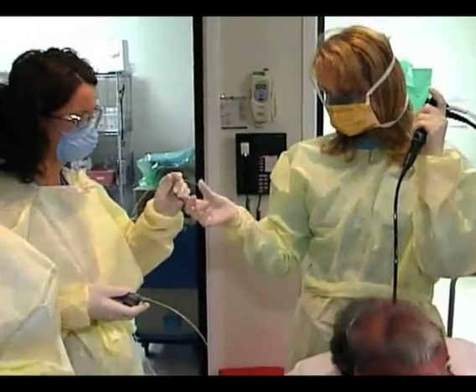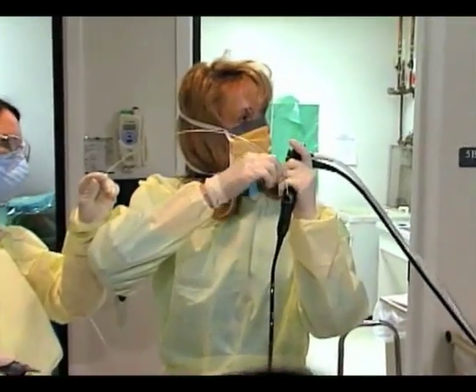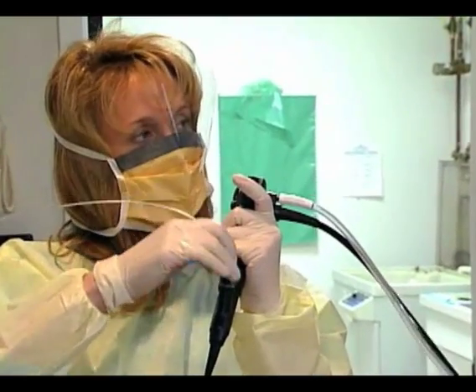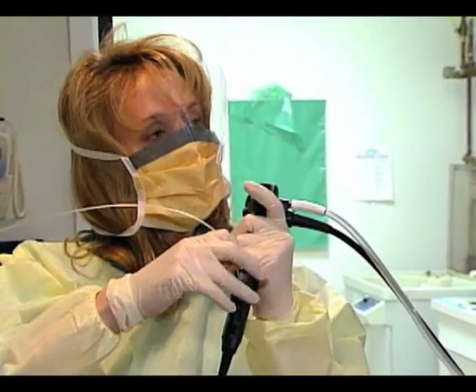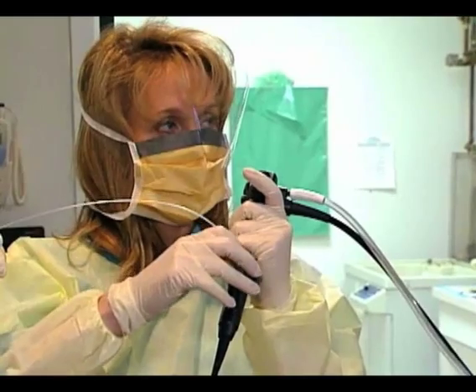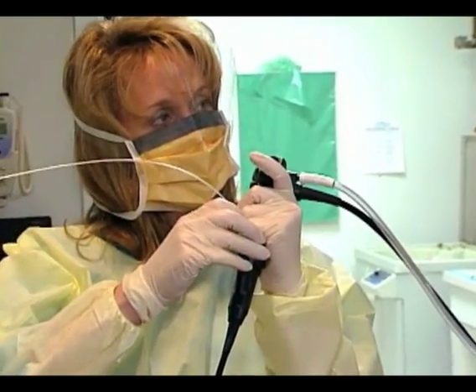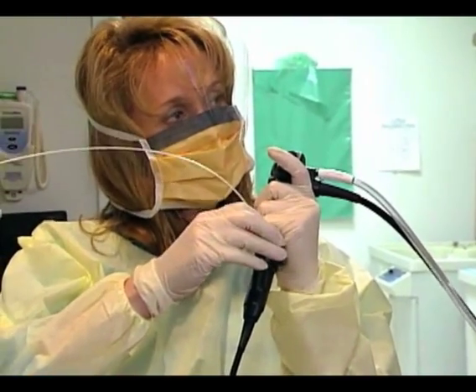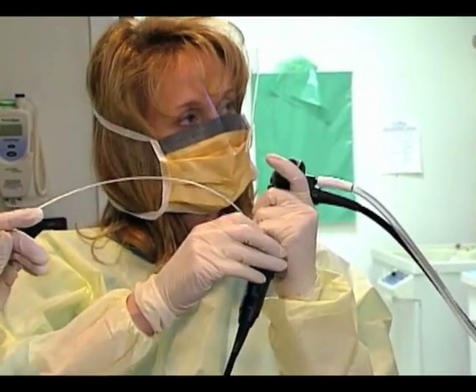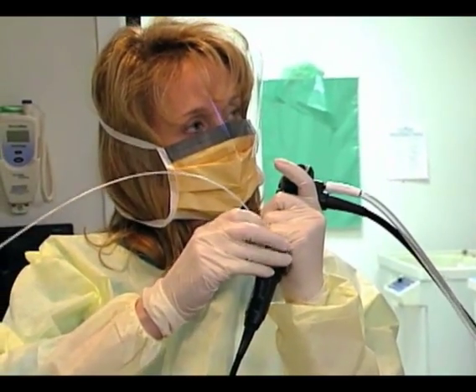I'm going to place this into the working channel. Because this patient's adenopathy lends itself more to the left main carina, just below the bifurcation, I will approach that aspect of the subcarina from the left main stem.